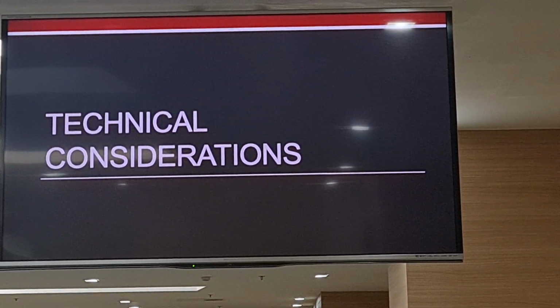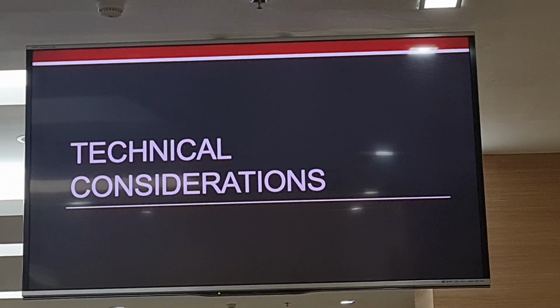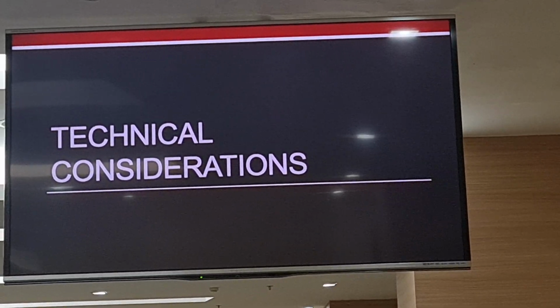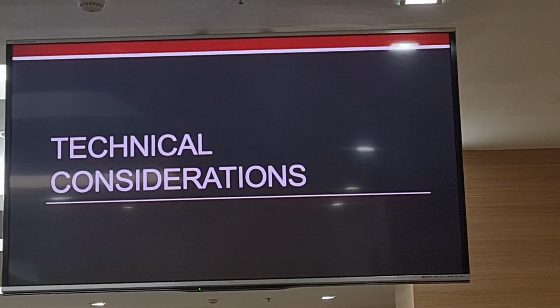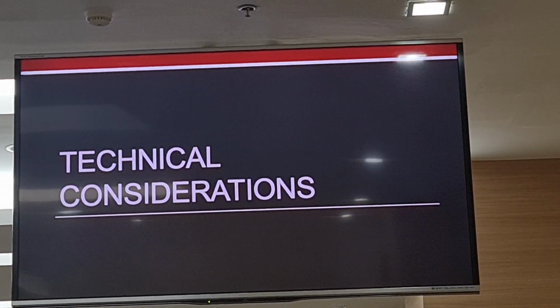Okay. The last part I'll just go through really quickly, in that, as with all quantitative techniques, the challenges are largely the same. It's really hard to implement this as an additional sequence that is going to add time, cost, and complexity. And so there are loads of different strategies that are being employed that I think are going to be particularly useful as we go forward and try to acquire more and more data to really evaluate these quantitative techniques.